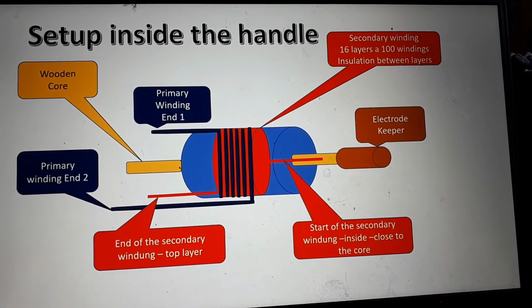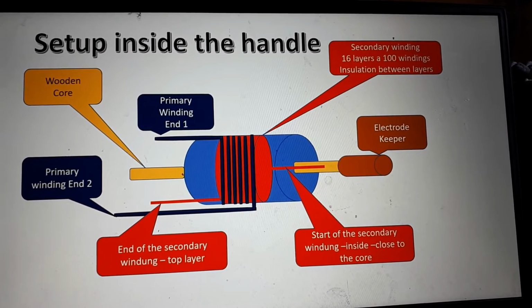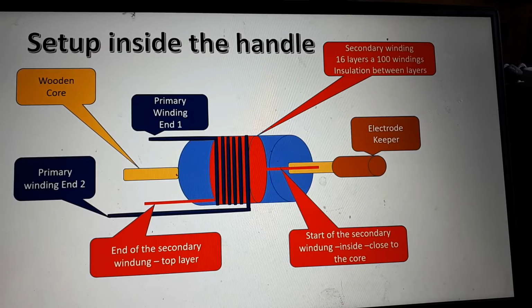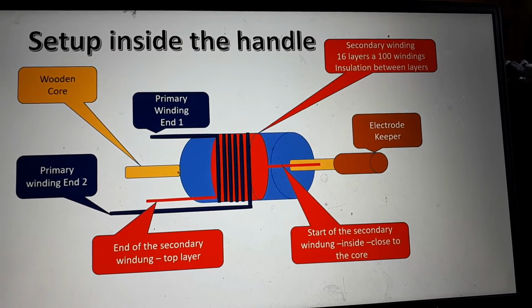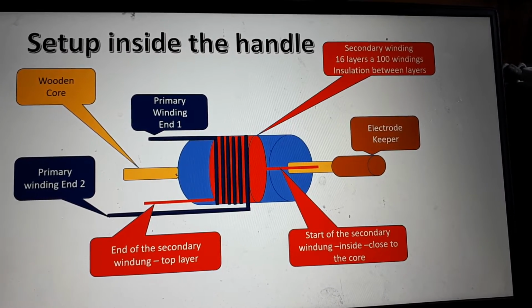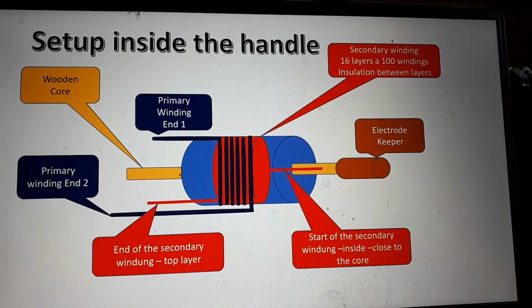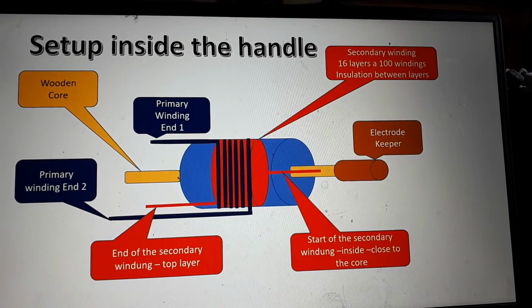For repair purposes, we have to know that the isolation of these secondary windings can be damaged. This is done by the heat. If you have these devices in use too long, the wire will get hot, and if the isolation is bad or damaged, it will burn through, and therefore the wire inside can be damaged, and there is no more energy throughput to the top of the handle. So if your handle really is defective, in most cases there is a problem with the secondary winding, which is very sad because you would have to unroll all the secondary winding, and this normally makes no sense. So if the secondary winding is damaged, I think that you need a new coil for your handle.